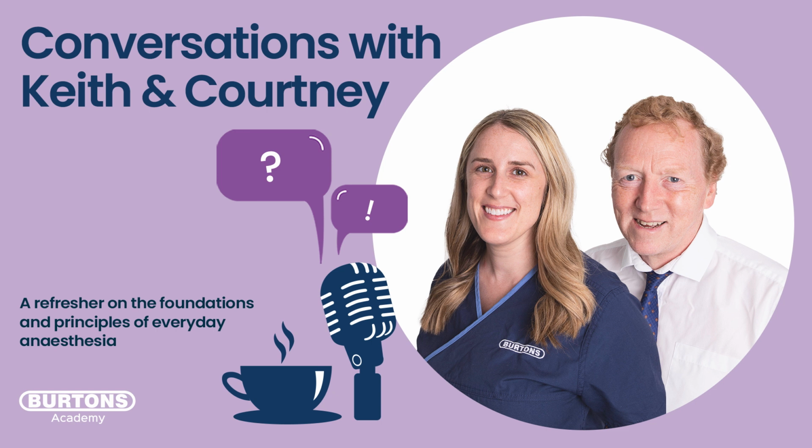I like to apply that in the recovery period, actually. If you start to see this trend down, because I've got a really cool video of a bulldog trending down in the pulse in the recovery period, and when it gets to like 80, 88 or so, we thought, let's intervene. But now I'm thinking in my head, I should have hurried. That was a 30-second-ago indicator. He's probably even worse and worse and worse. So even your pulse ox isn't giving you breath-to-breath oxygenation status. There's still quite a delay in that as well.